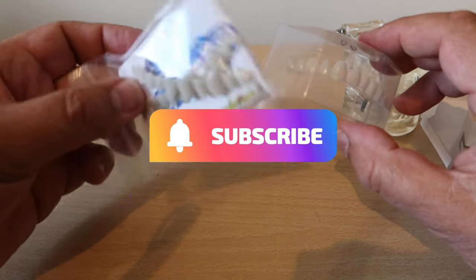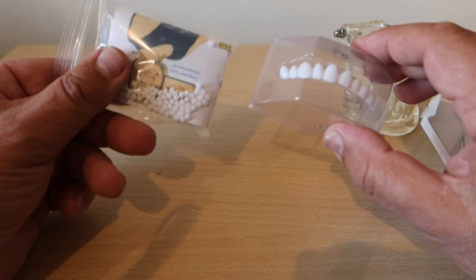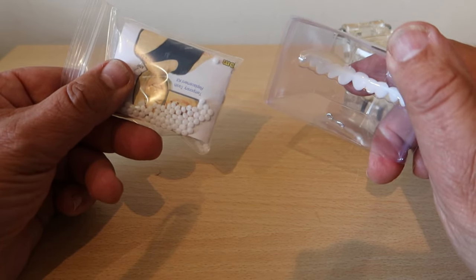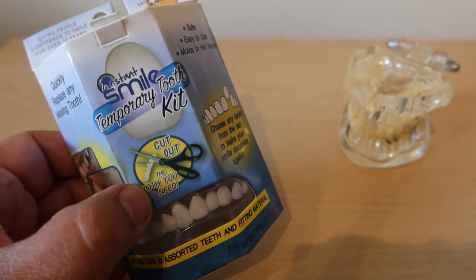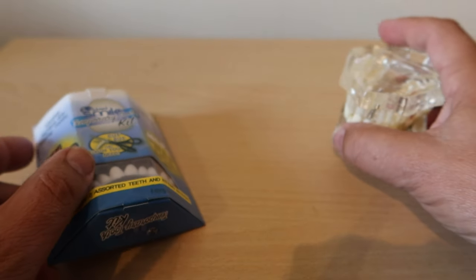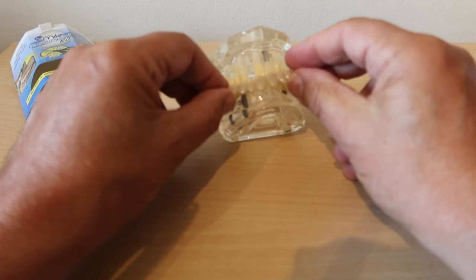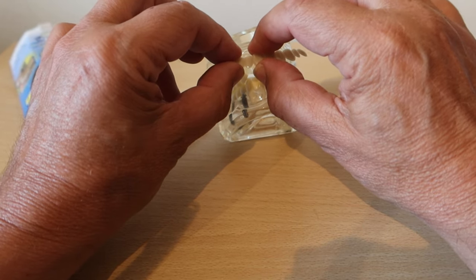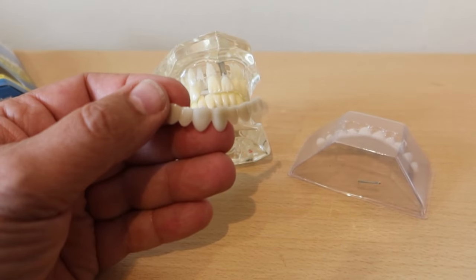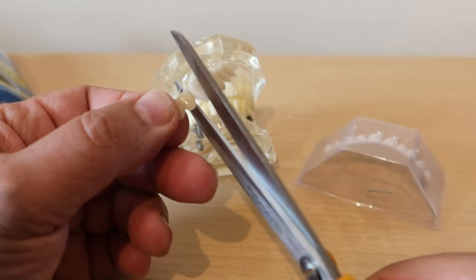Here we can see some different strips of teeth and they're different colours. You would choose the one that closest matches your own teeth. As you can see, this is the one that needs to be repaired, so we won't need all the rest of the teeth.